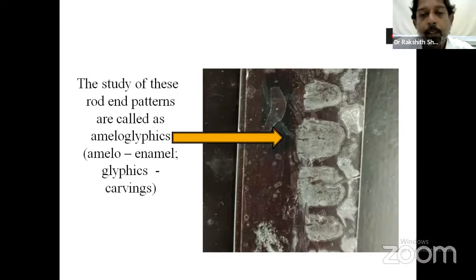So this is how we recorded the pattern of Ameloglyphics. We use a sellotape. This I'm going to describe as we move further. This particular pattern of the teeth could be taken on a sellotape, and this print which we are getting is what we are talking about, Ameloglyphics. This print is going to be different for me, and for maybe Manushya, maybe all of y'all.